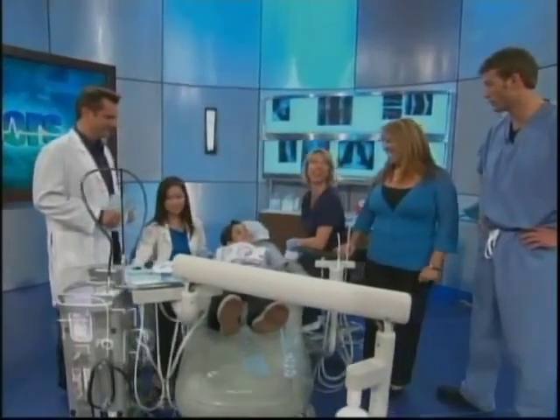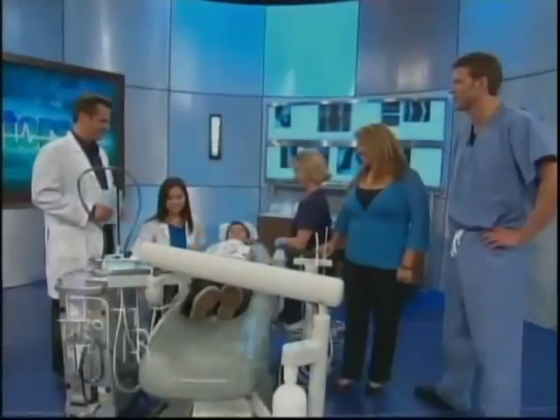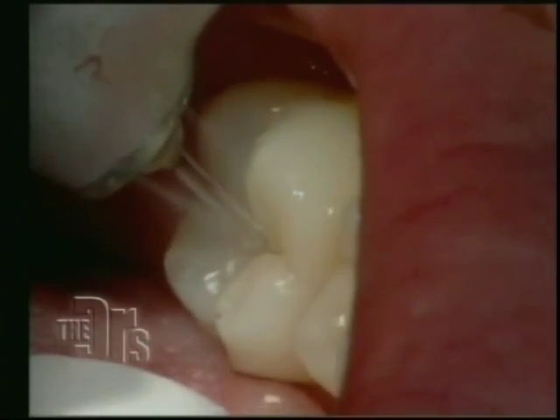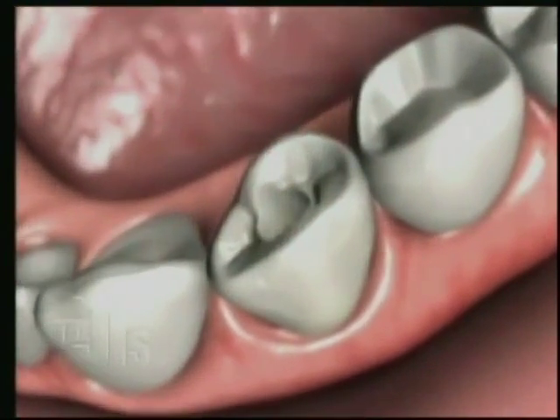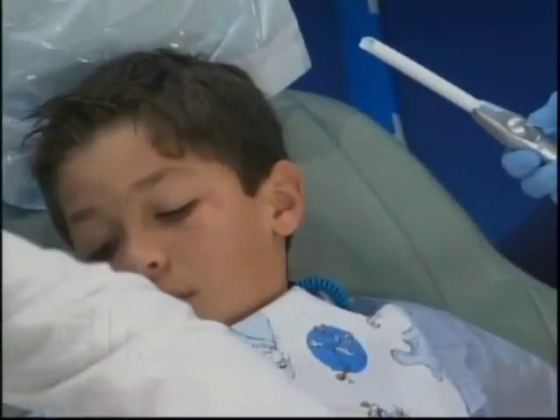Of course not. You're not going to get one — that's the beauty of this. The Water Lase is just like a water gun. It squirts water into the mouth, chips away the decay, and then the cavity is all gone. The patient feels no pain, is nice and comfortable, and wants to come back to the dentist because he had the best cavity filled ever. This is a great tool for adult patients too. They can also hop in the chair, get their fillings done, and leave without having a numb lip or tongue.